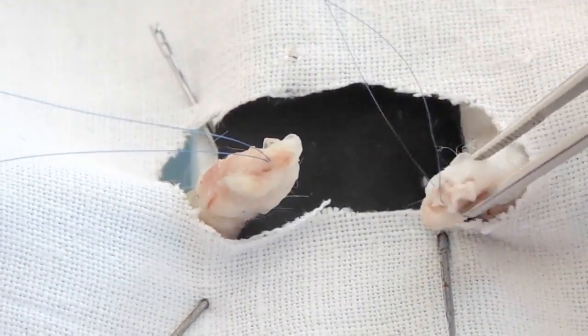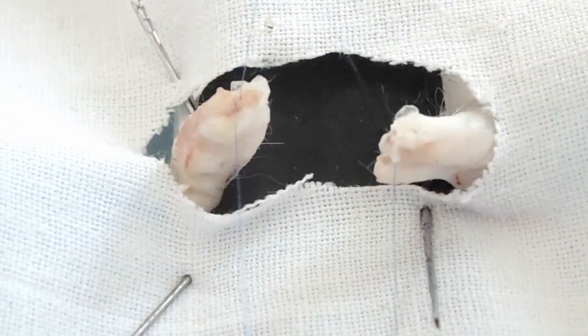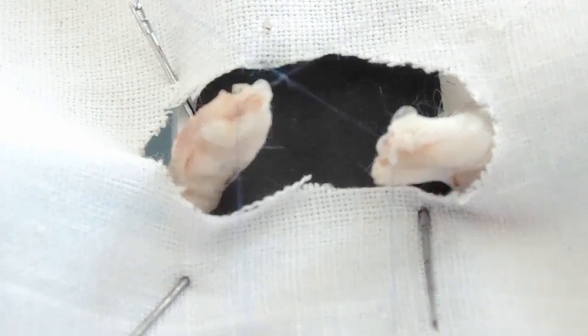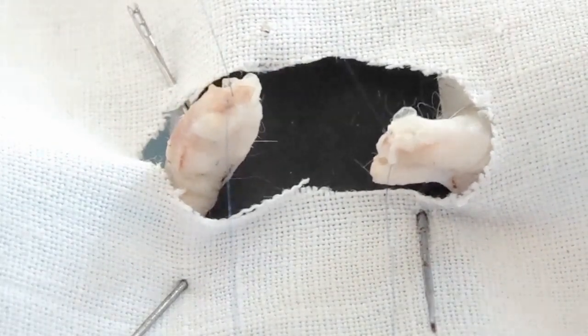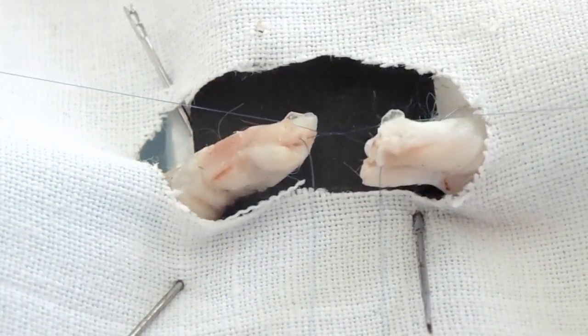At the final stage, the three ends of the filaments from both tendons are connected in pairs. In this case, knots are located inside the tendon.